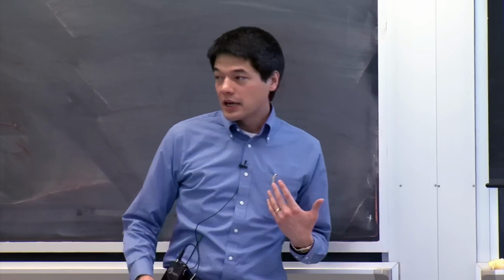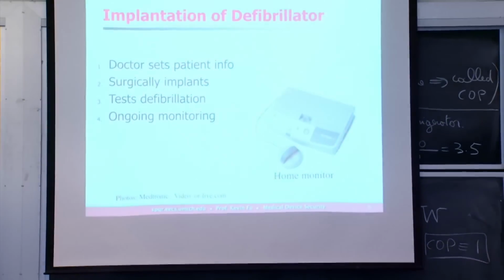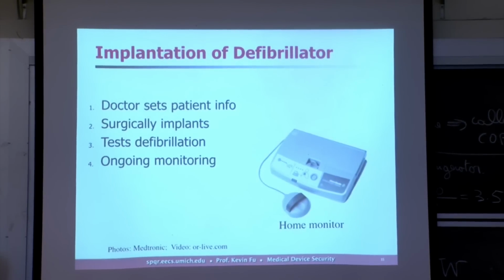So after that's implanted into the body, the patient is sewn up. They do some testing, and typically the patient will receive what looks like a little base station. It's like a little access point. It's very proprietary. Typically, they speak a proprietary RF to the implant so it can gather all the telemetry so that it can send it back up through the cloud, typically through a private cloud, so that the healthcare professionals can keep tabs on their patients. So for instance, if you notice that there's some odd measurement coming from patient Mary, you might call up Mary and say, you should really make an appointment and come in because I'd like to see what's going on with your defibrillator. So one of the nice things about the wireless is they're able to have more continuous care rather than come back in a year.